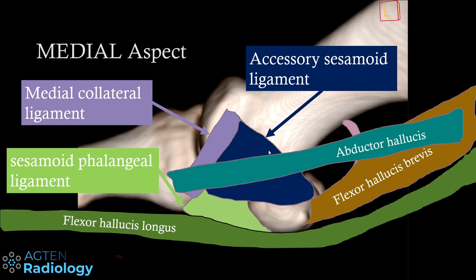This is a sagittal view from the medial side, which should give a better understanding of these different ligaments. The medial sesamoid is here, with the flexor hallucis brevis inserting there. From the head of the first metatarsal bone you can see the medial collateral ligament running obliquely — similar to the thumb at the metacarpophalangeal joint. This is now the accessory sesamoid ligament, which is somewhat triangular in shape, blending in with the sesamoid and connecting it to the metatarsal head. There is also one on the lateral aspect.